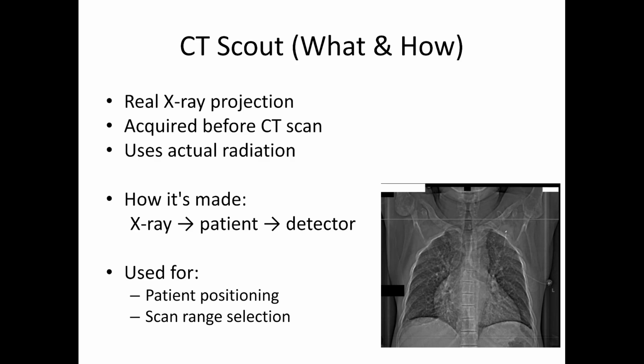Clinically, the CT scout is used to define the scan range and plan the axial CT acquisition. It is not used directly for treatment setup or dose calculation.